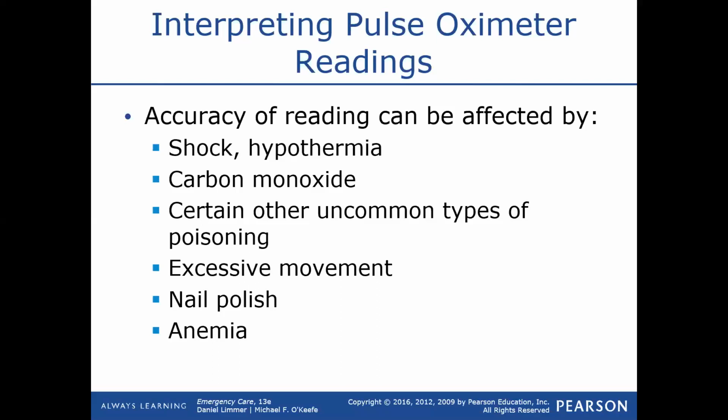Okay. The accuracy of reading, sorry, I went on a tangent there. Certain other uncommon types of poisoning can affect it. Excessive movement can mess with your pulse ox reading, and nail polish, anemia.